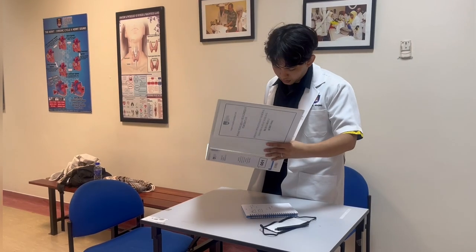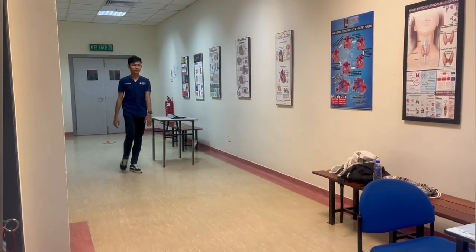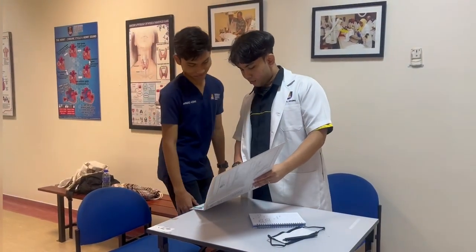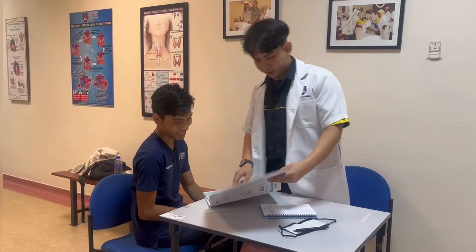Okay, just like usual, just go to the radiology department according to your appointment. Just wait there until the radiographer calls your name. So for example here, check the patient name. Is it true that your name is Abdul Rahman bin Wahid?